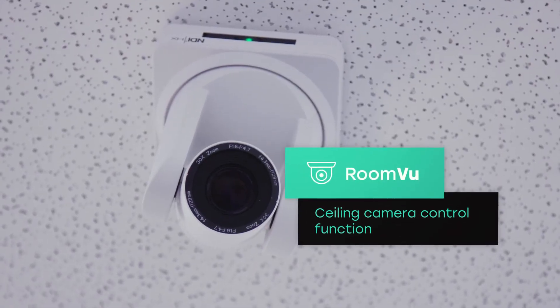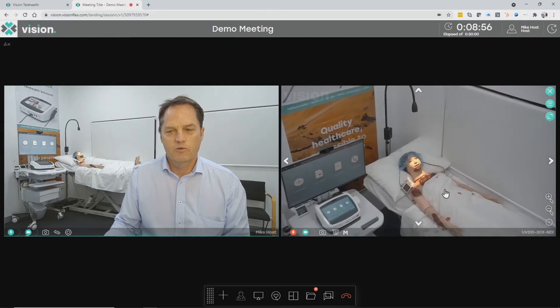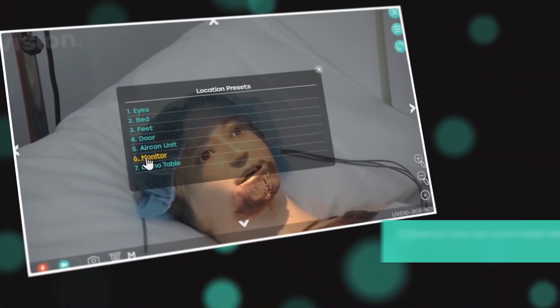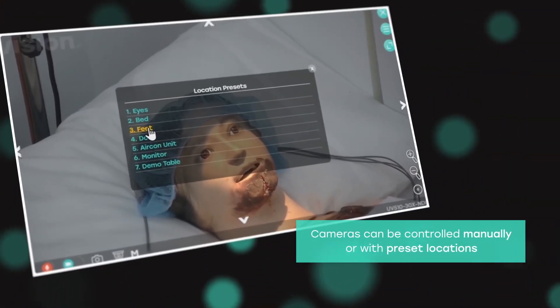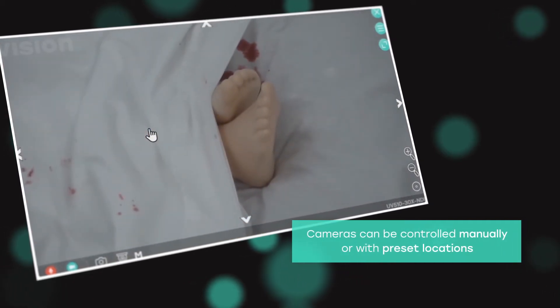RoomView is a function which allows us to control pan-tilt-zoom ceiling cameras through the video conferencing system. Those cameras are controlled through a very intuitive user interface which allows click-to-zoom and drag-to-zoom functionality, and we have memorised locations allowing the cameras to be driven directly to the patient's eyes, their feet or the ECG screen.